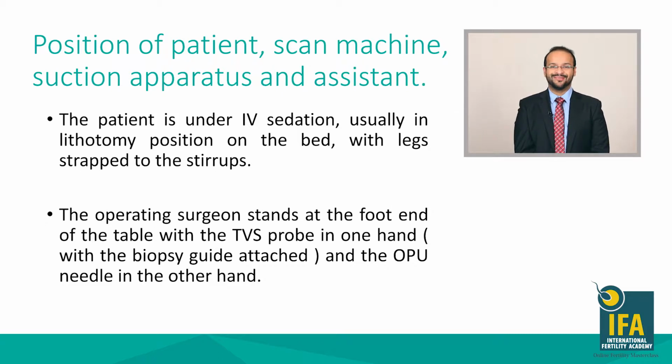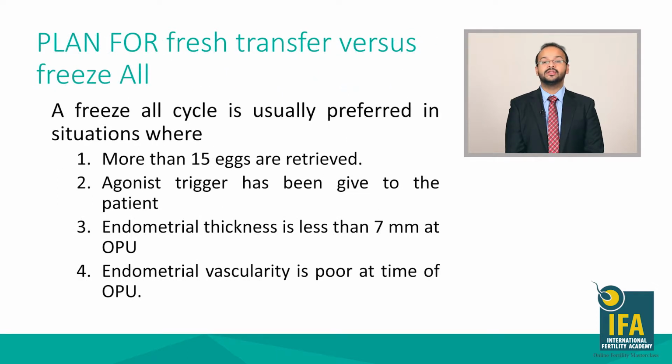During the procedure, the patient is under IV sedation, usually in lithotomy position on the bed, with legs strapped to the stirrups. A freeze-all cycle is usually preferred in situations where 1. We have more than 15 eggs that have been retrieved. 2. Where the agonist trigger has been given to the patient.